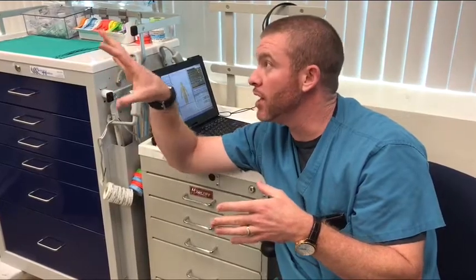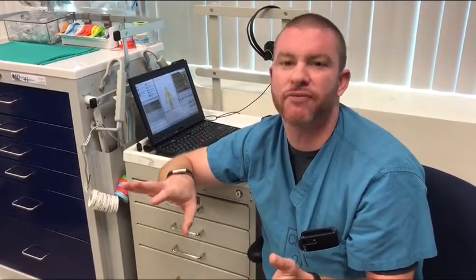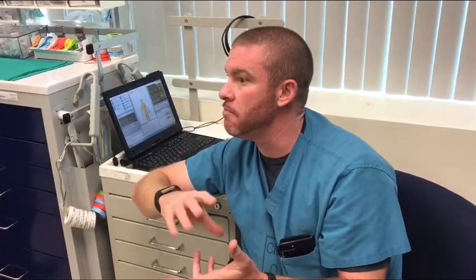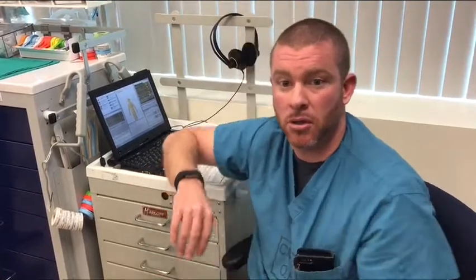He's breathing at a great rate. I want to know his tidal volumes. So you would ask me, what are his tidal volumes? His tidal volumes, we'll say, are 600. Is 600 an adequate tidal volume? It's decent, right? At a good rate. So is he meeting the criteria to be extubated? Getting real close. What else does he need to do?